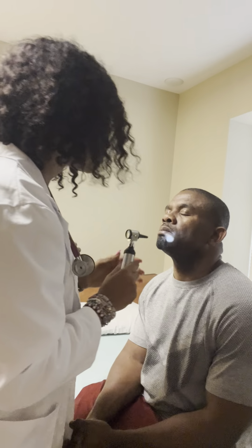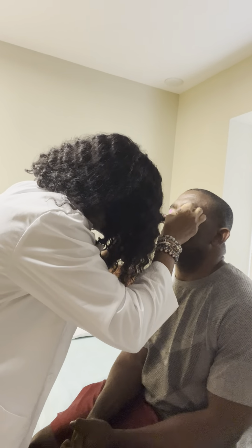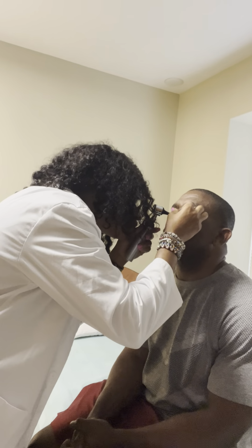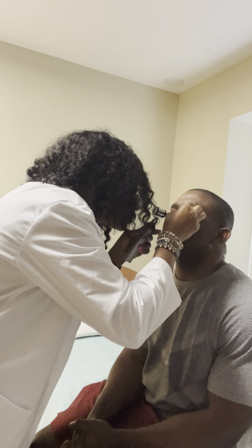I'll angle inwardly, checking the septum, which is not deviated and is a straight line, with no swelling. It's pink and moist. I'll do the same thing on the other side, tipping it up and checking the turbinate, which is pink, clear and moist. I'll check inwardly at the septum, which is not deviated and is midline, with no swelling, no drainage, and it's intact. Everything's normal.